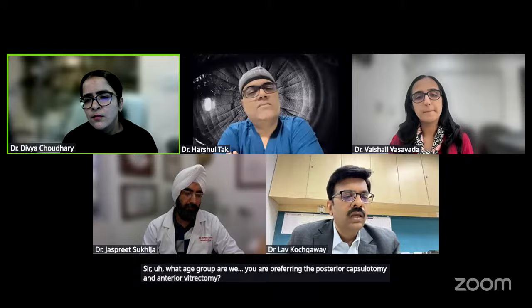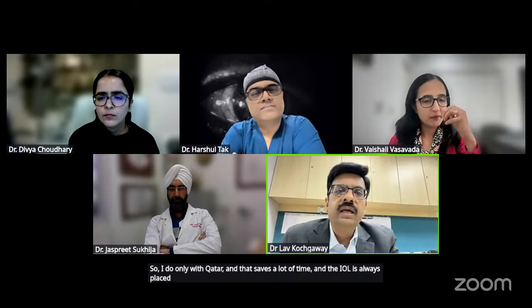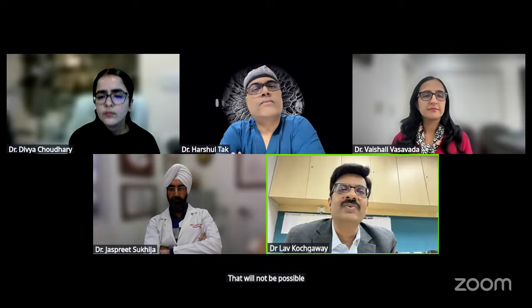Sir, what age group are you preferring the posterior capsulotomy and anterior vitrectomy? See, there's no harm doing what I do. Even in early teens, I will do a posterior capsular excision and anterior vitrectomy. There is one difference between what Dr. Vaishali has shown and what I do: I have given up manual posterior capsular excision. So I do only with cutter, and that saves a lot of time, and the IOL is always placed in the bag. But in that case, the optic capture that she has shown will not be possible when we are doing it with a cutter.